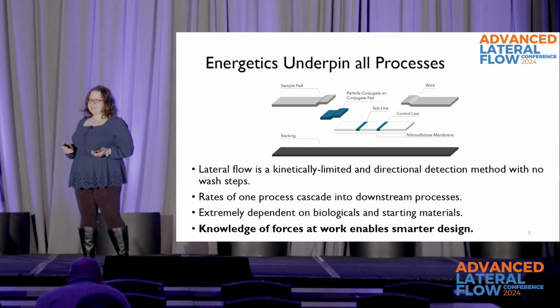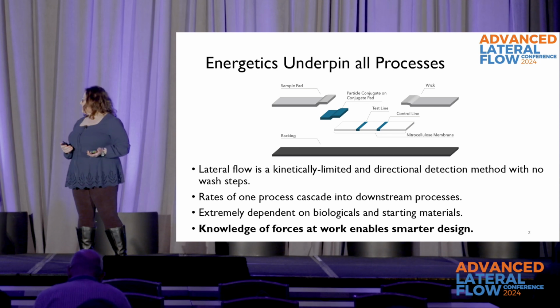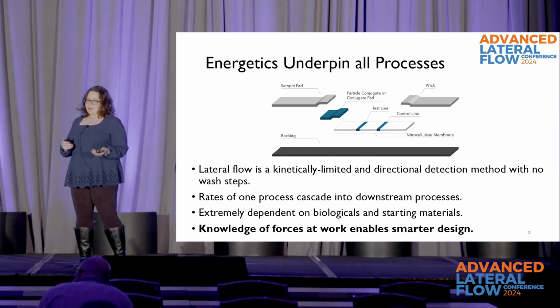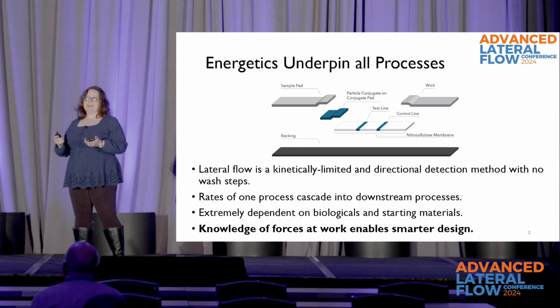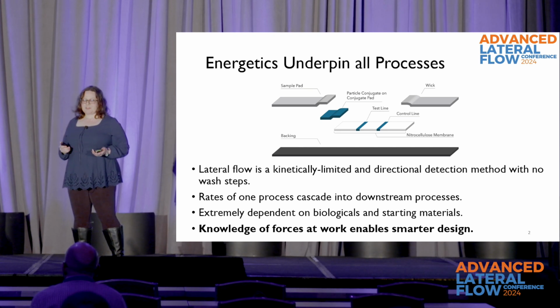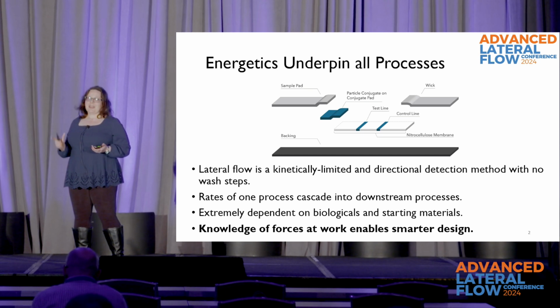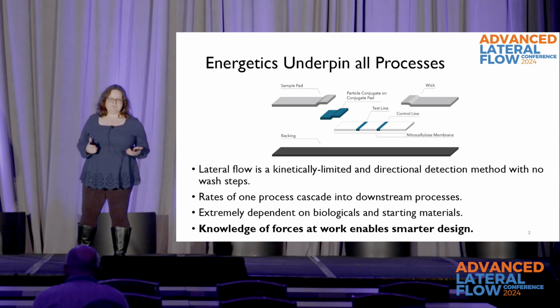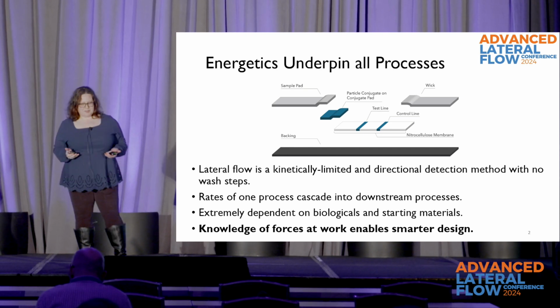And beyond that, if your sandwich is not made, I'm using a sandwich immunoassay for this, all your conjugate's going to end up in your wick pad. So with a sandwich, you might be forming at least one part of the sandwich, so your conjugate might hit that analyte, but if that analyte is not then captured by the test line, that's it. Your particle ends up in the wick pad and your sensitivity is lost.